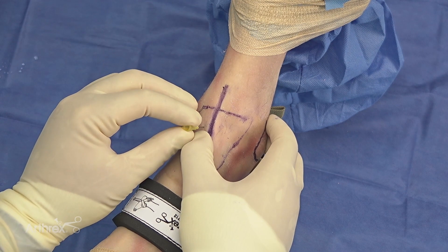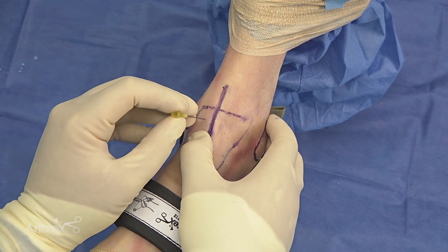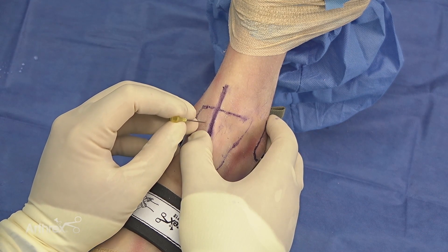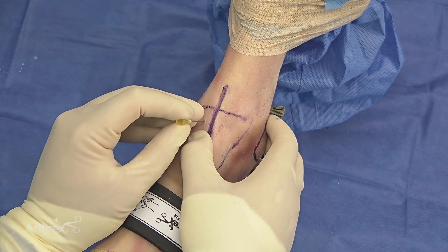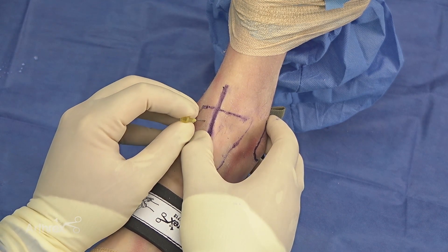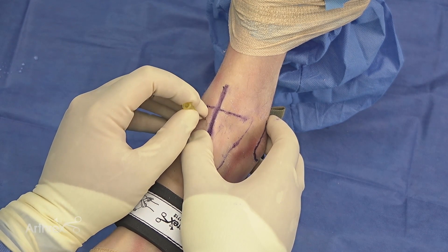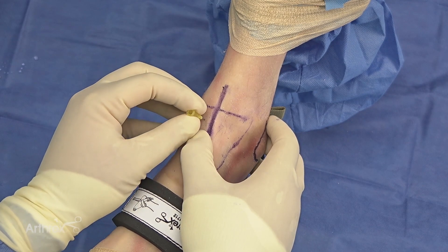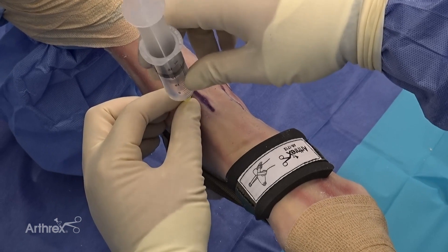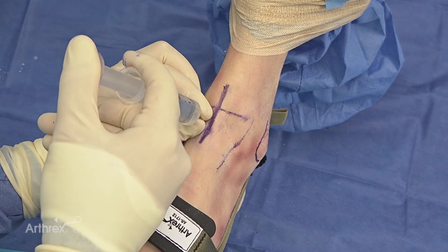As we get into the ankle, I like to palpate up a little bit further until I find where the tibial plafond is, and then I'll work my way backwards until I'm in the joint and can feel good excursion both above and below with my needle. I'll then insufflate using approximately 10 cc's of normal saline before getting into the joint.